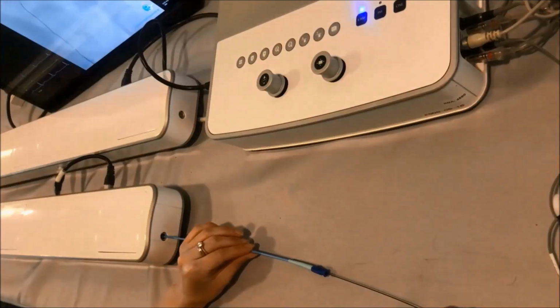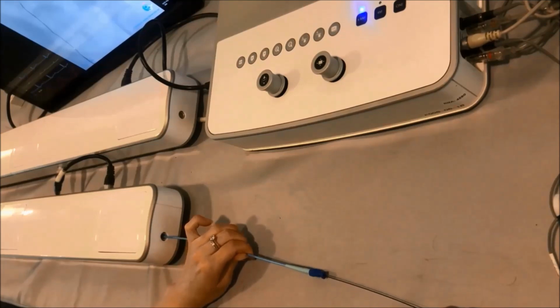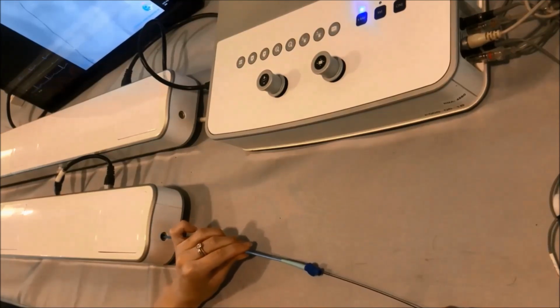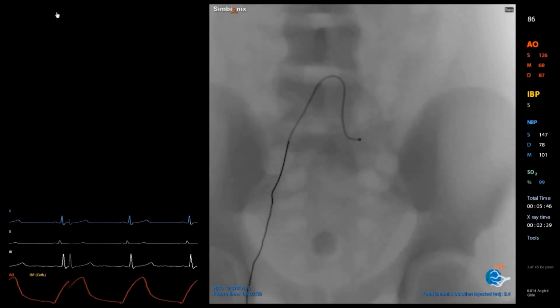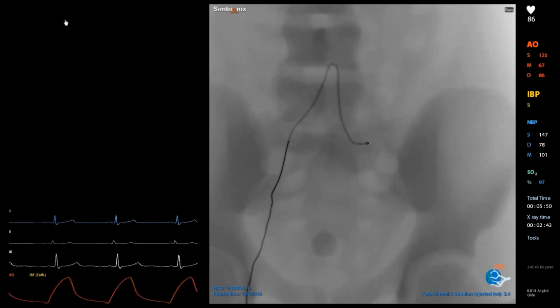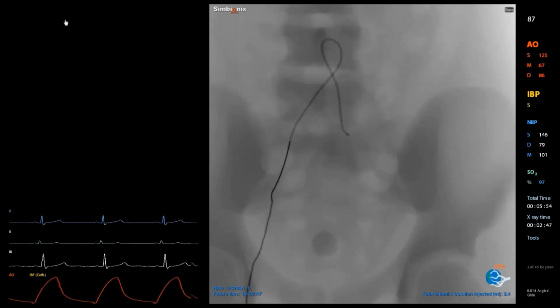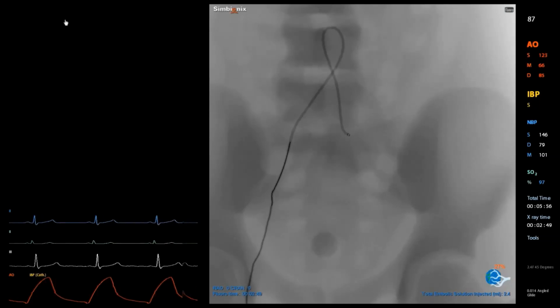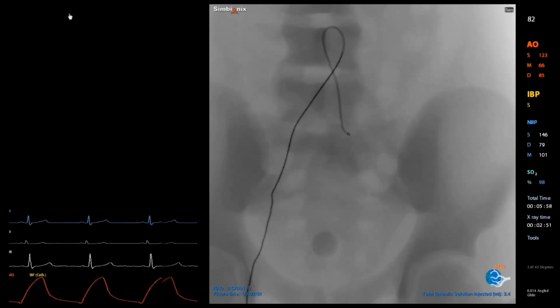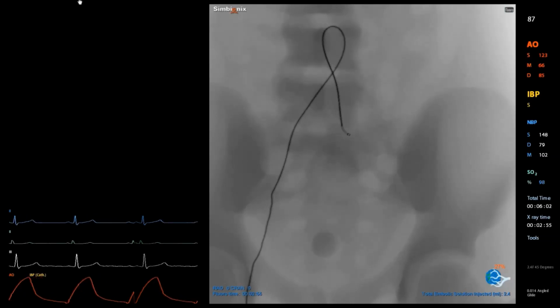You can use the Waltman loop. Also, you can use the Simmons catheter. If you are using the Simmons, you can use the Simmons 1, or use the Carnevale prostate catheter, that is the CPC catheter, that you have in 3 lengths: 5 centimeters, 10 centimeters, or 15 centimeters.